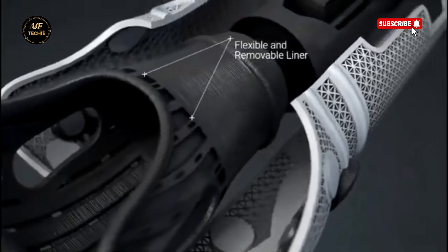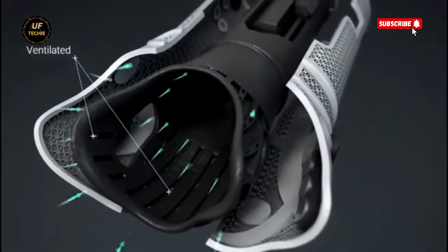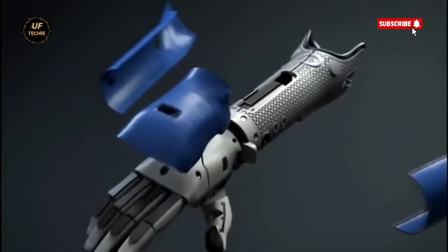Despite being incredibly advanced, the arm is surprisingly lightweight — under one kilogram — making it easy to wear all day without discomfort or strain. It's also strong, capable of lifting up to eight kilograms with ease.